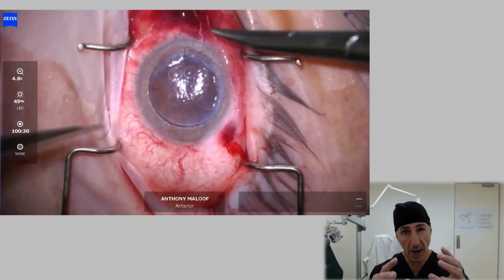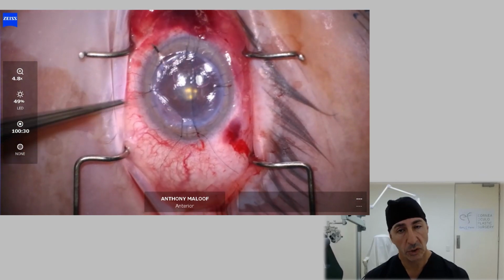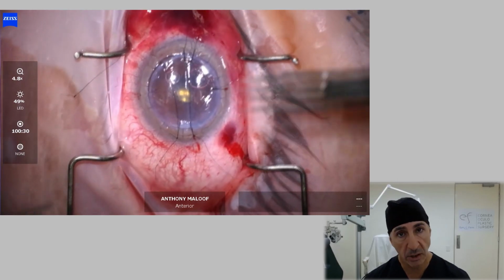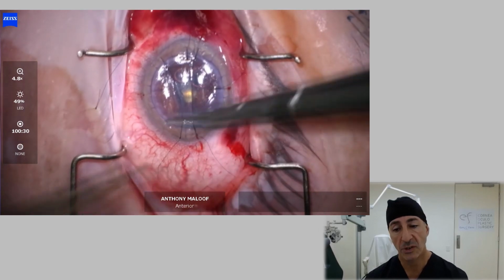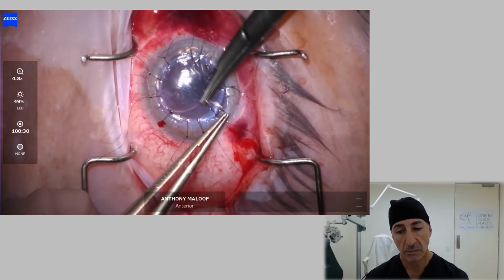You're suturing really, really good tissue into really flaccid tissue. So this suturing is really tricky. It's different from normal. You can see that I've put 2 sutures opposing each other, and you just got to keep going around, and all of them get replaced until you've got the right shape and you've got the right tension. The tissue is so flaccid you can't predict. There's no nomograms or algorithms. You've got to judge each one as you put it in. So you put it in and then change it.